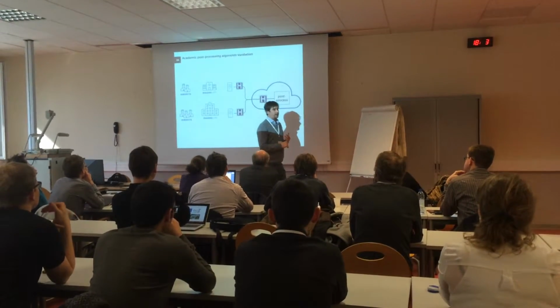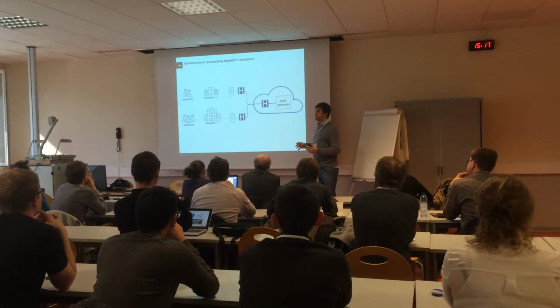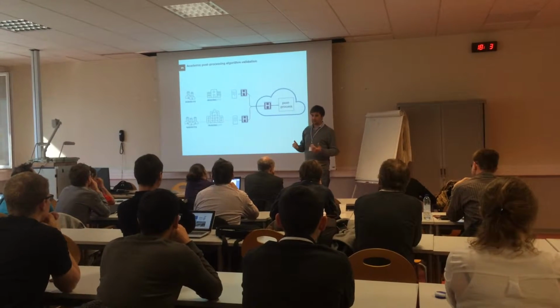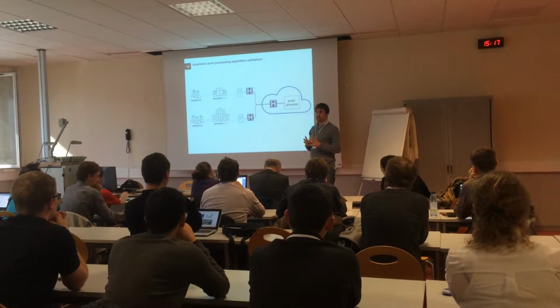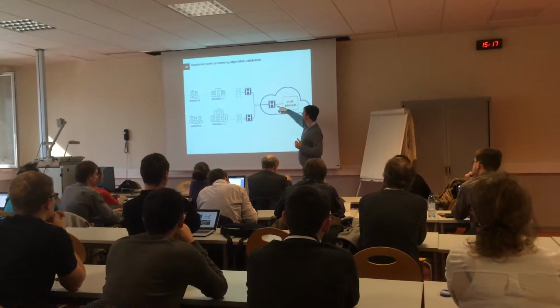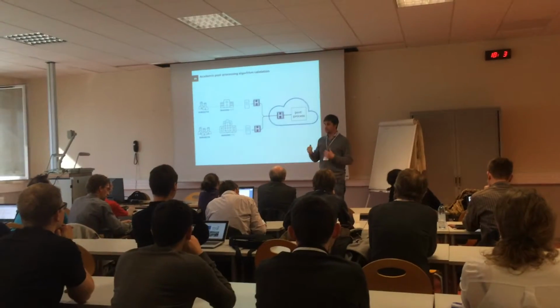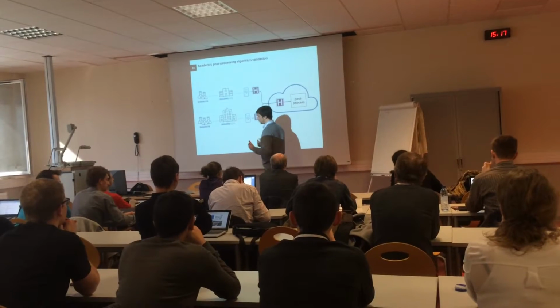Research centers have been asking us to set up Orthanc instances in the cloud so that the hospitals that are working with them can centralize the images on one central Orthanc instance, and then they can run their post-processing algorithms and do tests on them so that it works smoother.